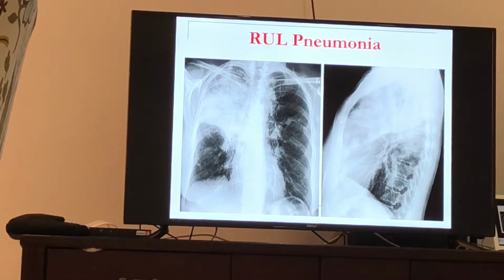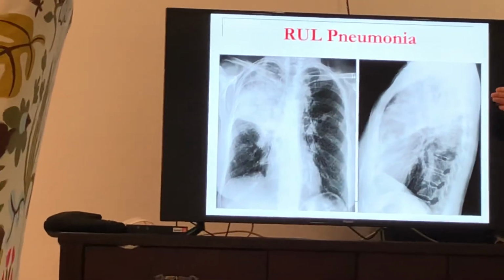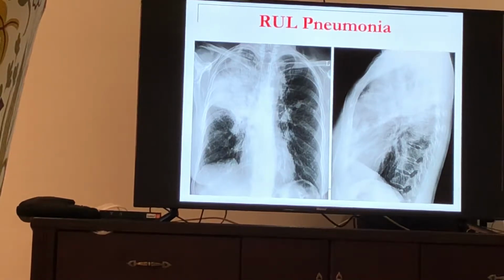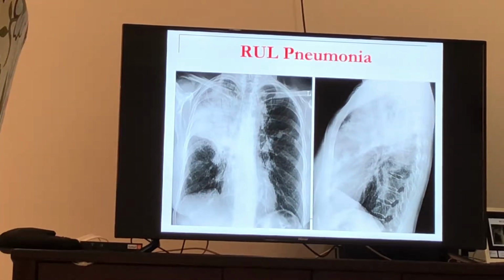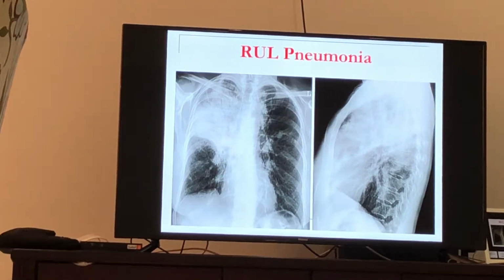It's just more dense. Does it correlate clinically? Does this mean this patient's more sick than the one we saw before? No. Maybe the one we saw before is even more sick and more tired and having more systemic inflammatory response than this one. Will it differ in the management? No, it should not. Same management, same outcome most likely. This is the 10% mortality here, 10% mortality. You know what I'm trying to say? It doesn't, but it's still just different radiographic findings. Okay?